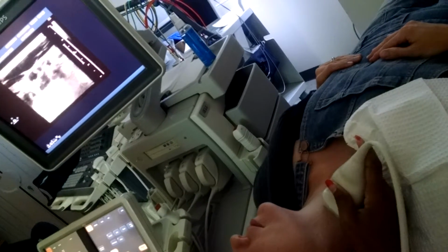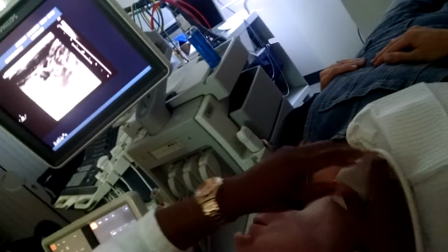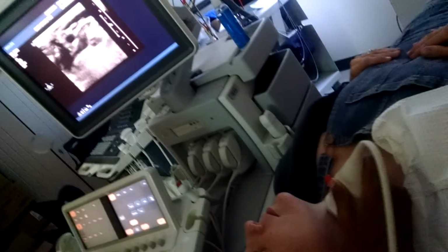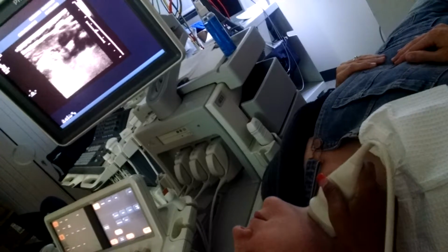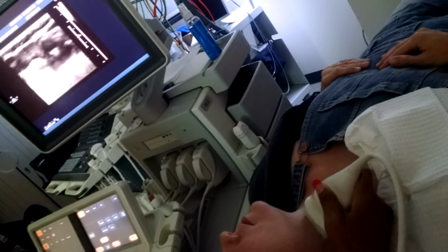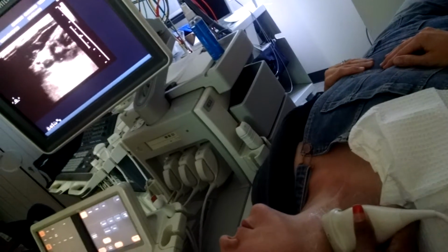I come back down the neck. And I'm going to go longitudinal. Oh no, then I would freeze it, get my anterior approach, with the internal and external. So freeze that, label it. Then I would come around and do more of a lateral approach.